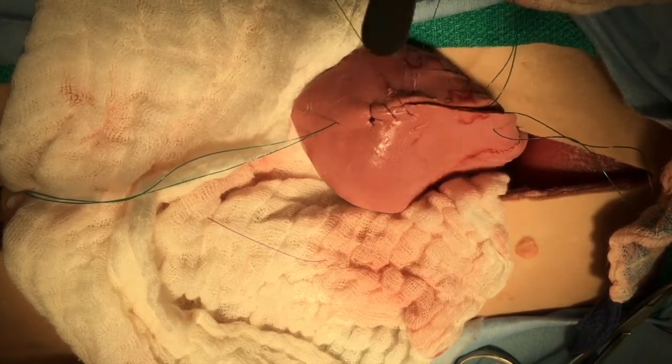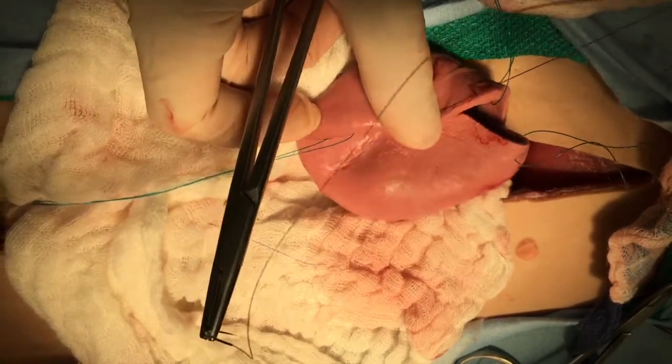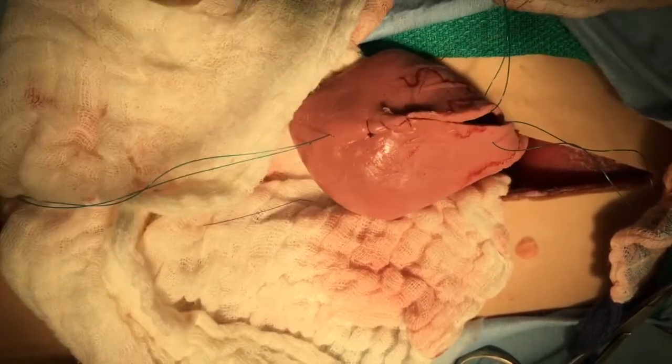The closure should not be too tight, but the tissues must be well opposed. We would leak test this closure by retrograde infusion of saline.